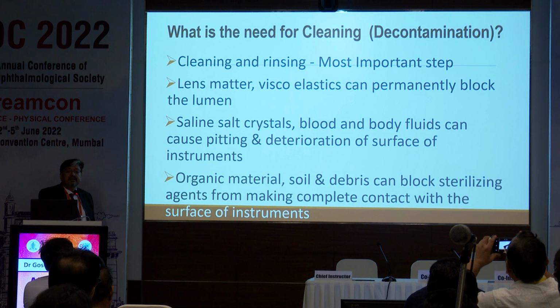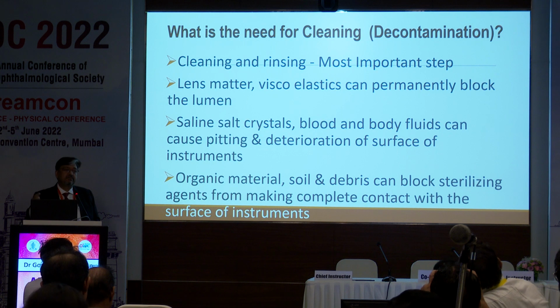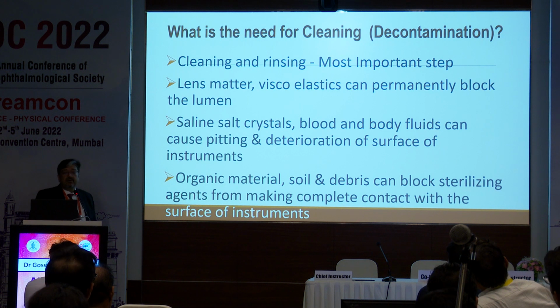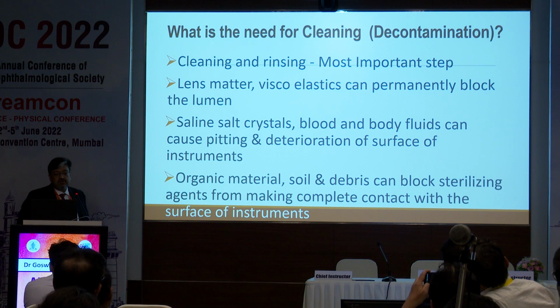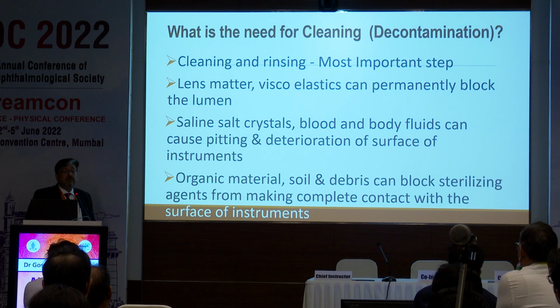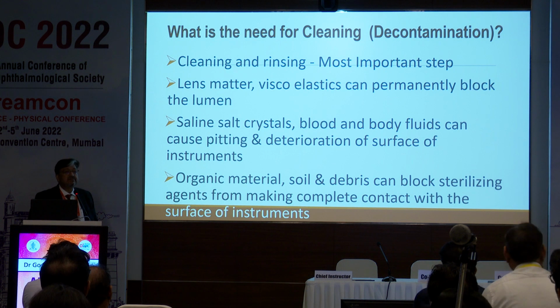And that is, cleaning and rinsing are most important, because many a time we use substances like viscoelastics, and the cortical matter which is present in the cataract may get stuck up in lumen instruments like the Simcoes or the IA cannula. There may be a lot of blood or fluids sticking onto the instrument, which can cause deterioration of the surface of the instruments and pitting during the sterilization process. And organic material and soil debris can block the sterilization agents from going in.